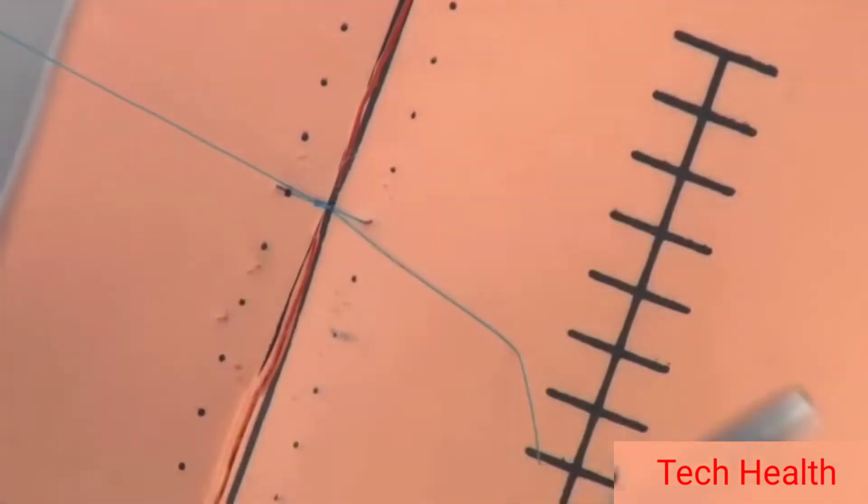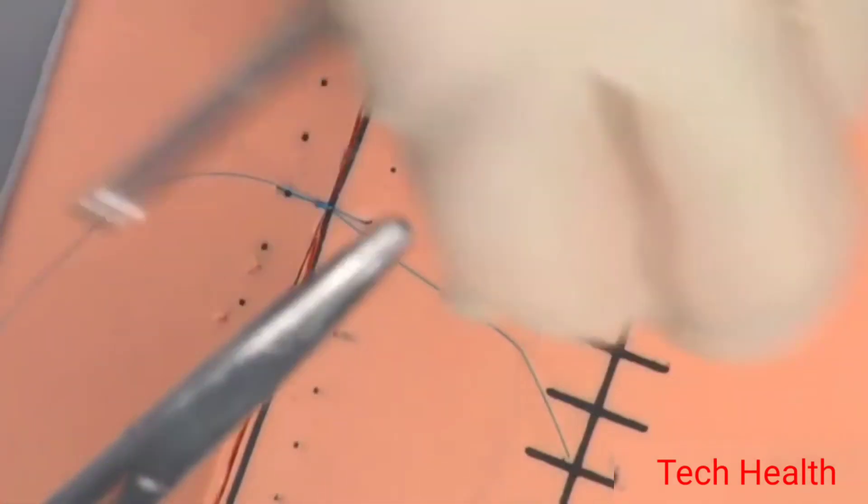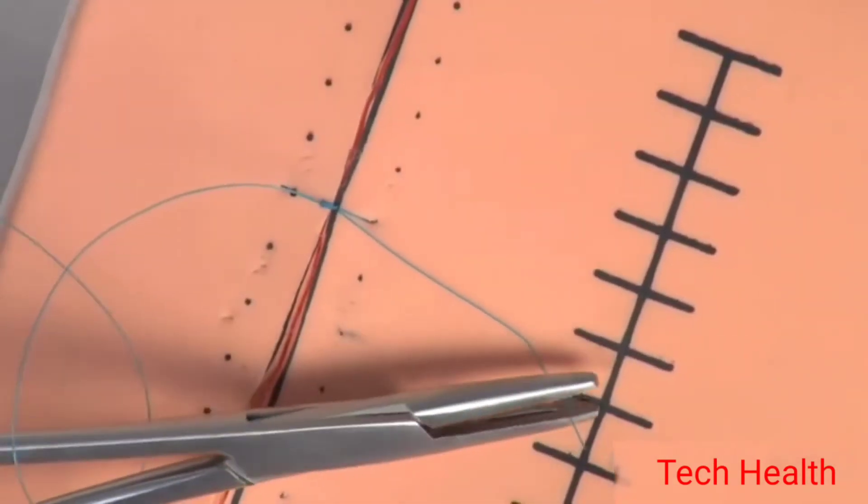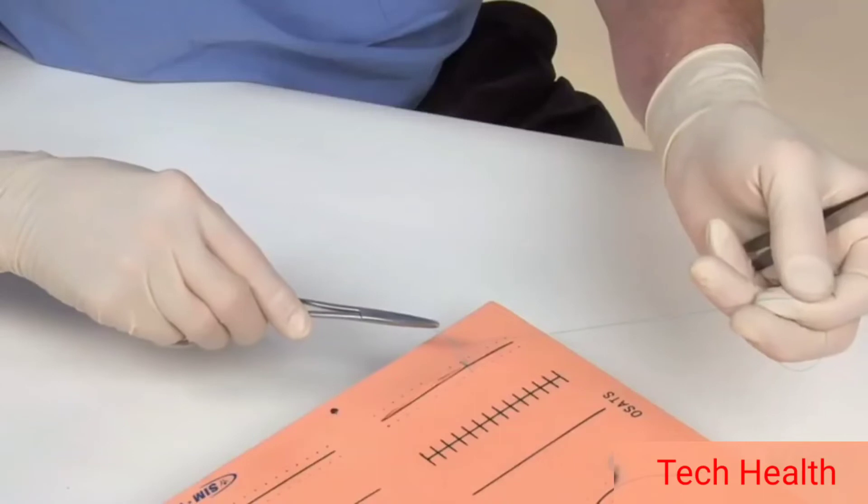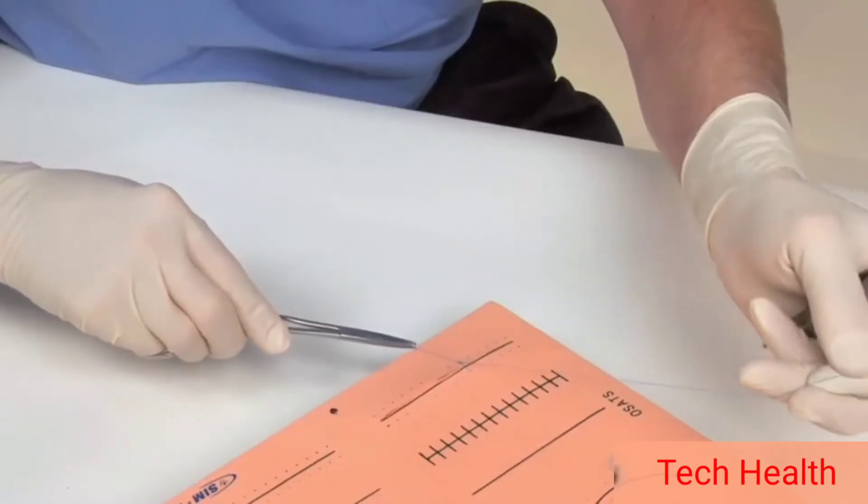Once again, start away from yourself. Move into the long end of the suture. Once around, grab the tag and pull it toward yourself.